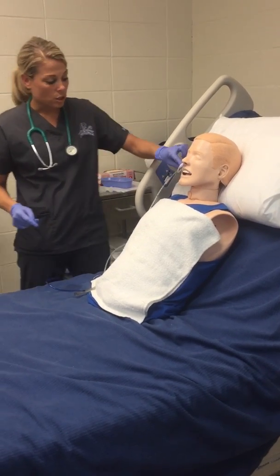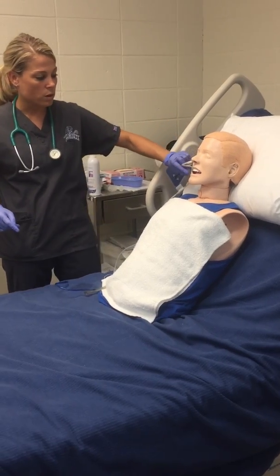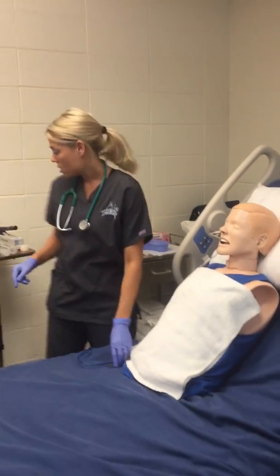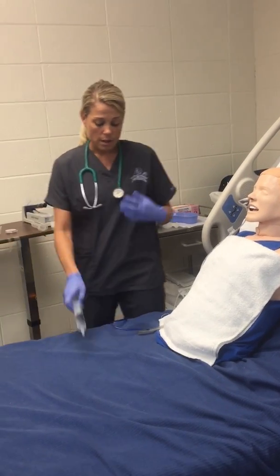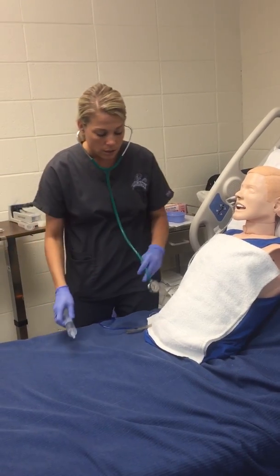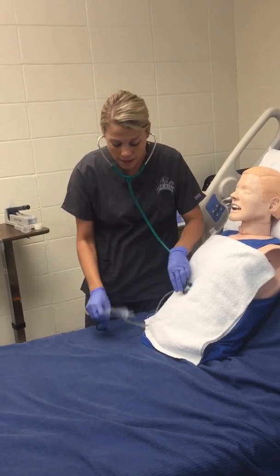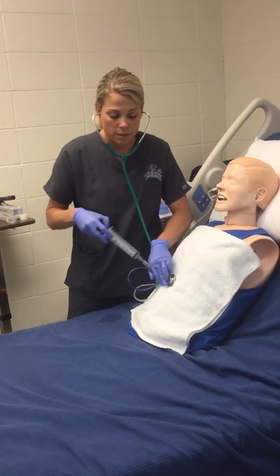Once it's temporarily secured, we're going to check placement. So there are a few different ways you can do this. One of the ways is you can pull up 30 mils of air in a syringe, and then using your stethoscope, you can listen on the abdomen while you inject the 30 mils of air, listening for a swishing sound.